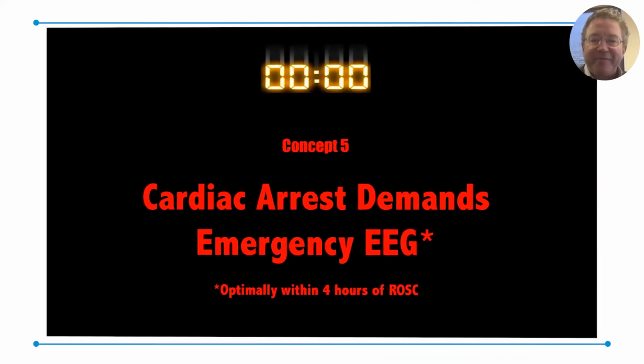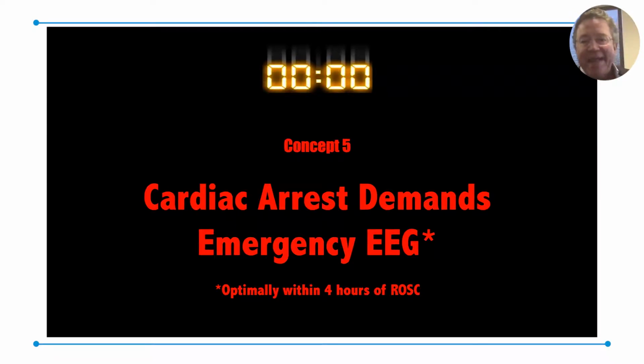So the final concept I want to leave with you is that, and this is not widely accepted, this is not what we consider to be what everyone should be doing right now. This is what I think will happen one day, which is that one day we're all going to understand that cardiac arrest demands emergency EEG. Now, obviously, in order to get there, we need more research. We need to test this concept and do studies where we are trialing more emergency EEG to replicate the findings from the Japanese studies and look at some of the other relationships and dynamics.